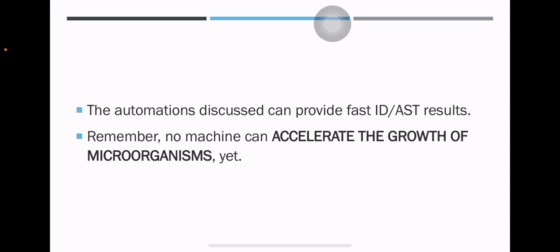Please take note, everyone, that all these machines give fast results, but remember that no machine can accelerate the growth of microorganisms. They can only detect growth faster or analyze it better.